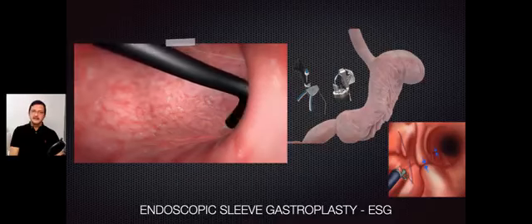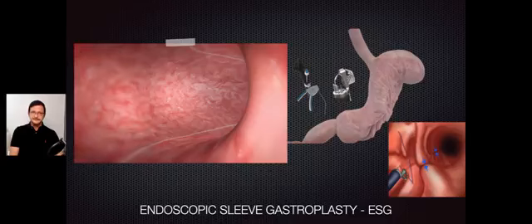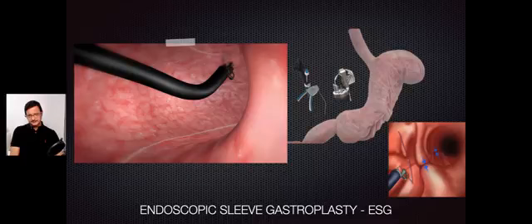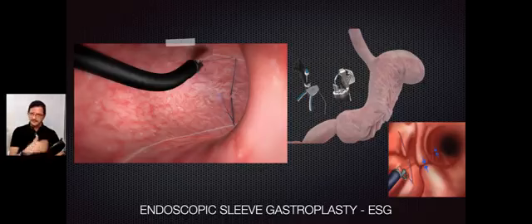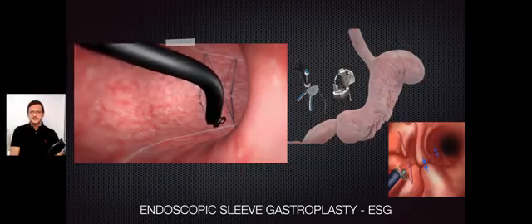It was the very beginning, so very few groups are still doing that. And with this suture machine, we go to the anterior wall, greater curvature, posterior wall, and there are different standards of suture. This was the initial one. Again, anterior wall, greater curvature, posterior wall.